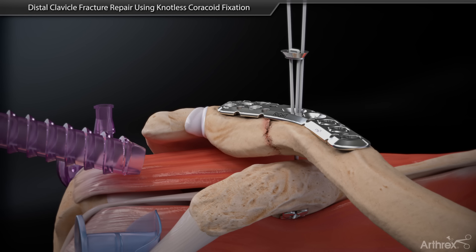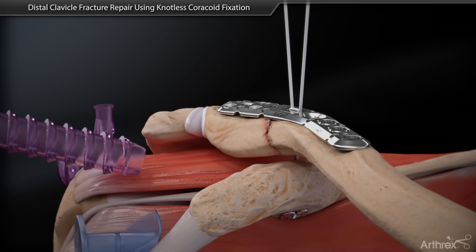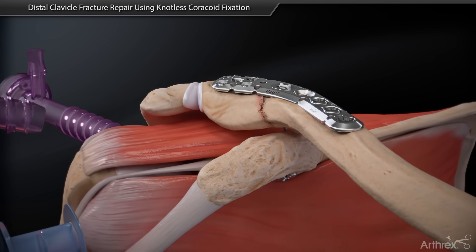Cinch the self-locking tightrope loops until the plate button seats into the plate. Cut the free suture limbs to complete the knotless repair.